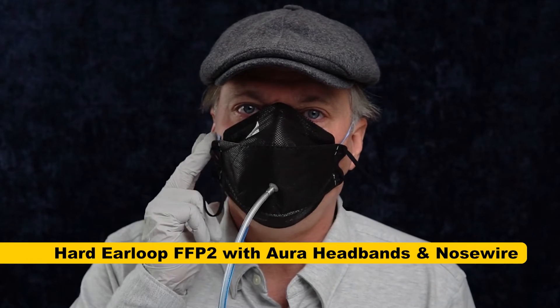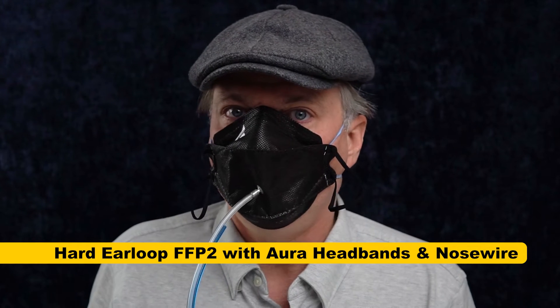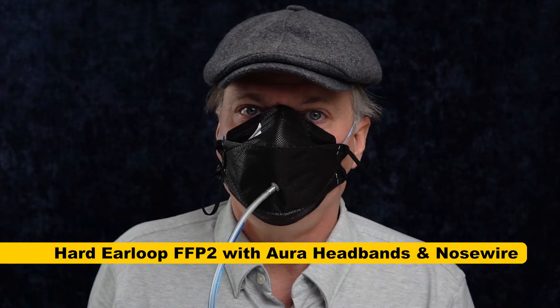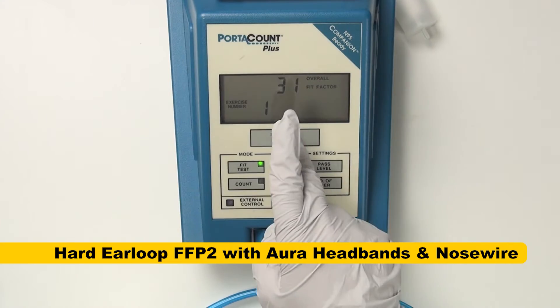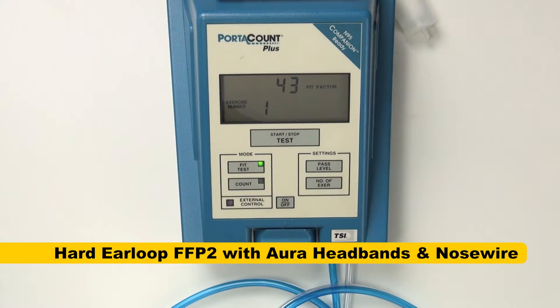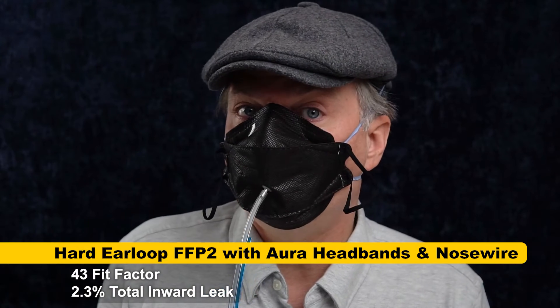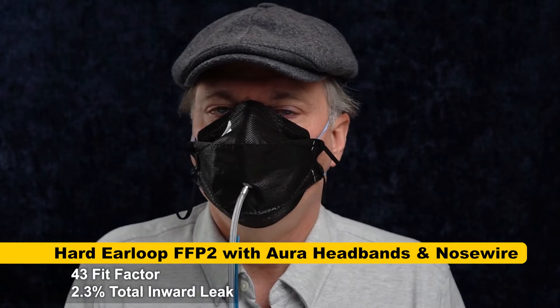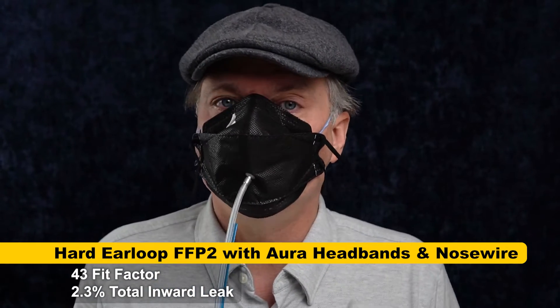Next, we're going to combine the new nose wire plus the Aura headbands and see if those two together make a difference. I've got the 3M headbands on along with the 3M Aura nose wire and it's feeling a lot more secure — I think this is an improvement. The result came back as 43, which seems significant — 43 is more than 30 and I felt like there might still be a slight leak at the side.